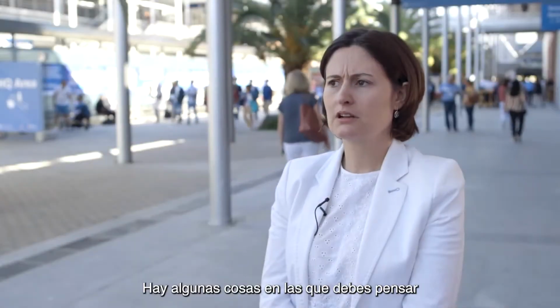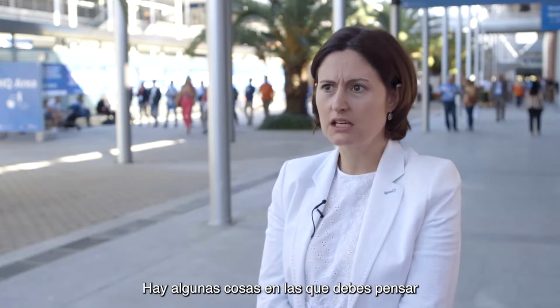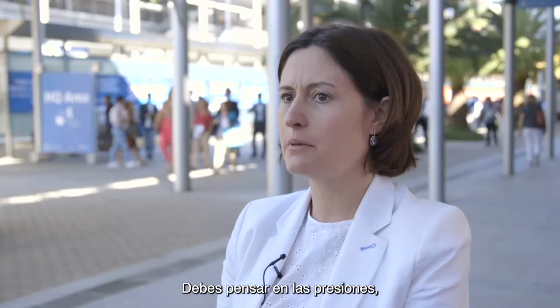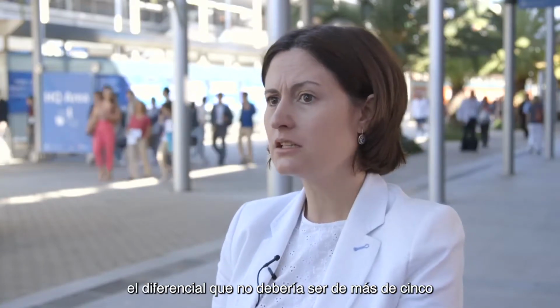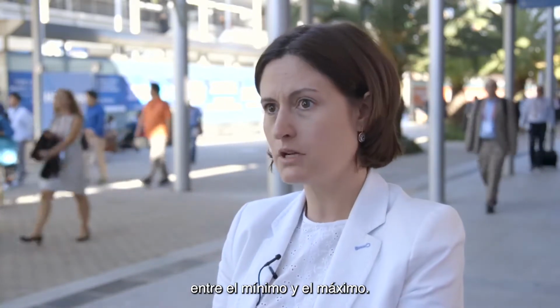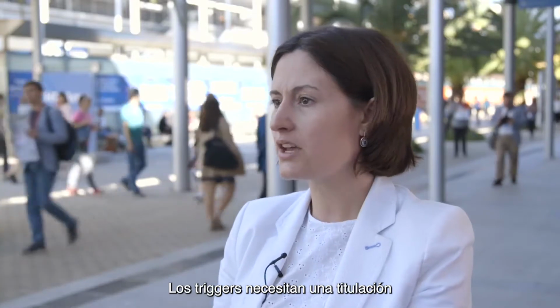There are some things that you must think about and apply in this kind of ventilatory mode. You must think about the pressures: the differential between the minimum and maximum can't be more than 5. You must think about the target volume that you want to achieve. You must think about the inspiratory time, which must be more than 0.8 in restrictive patients and 0.6 in obstructive patients.